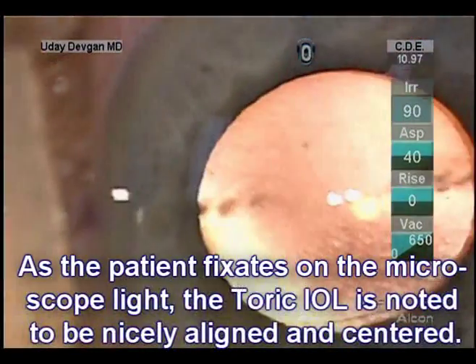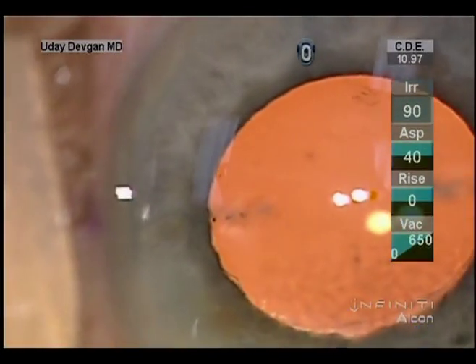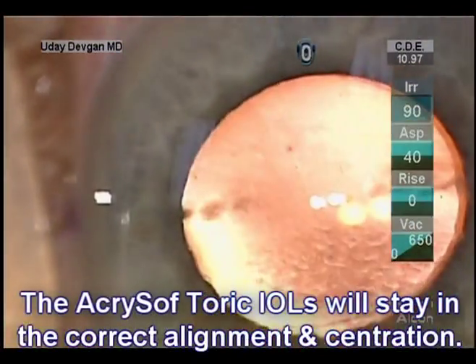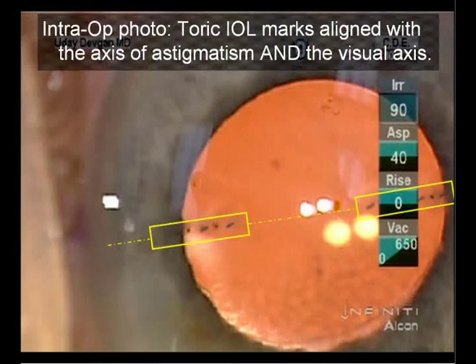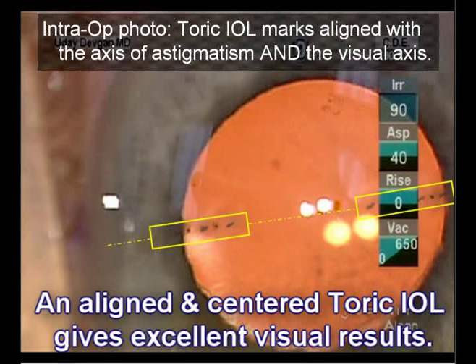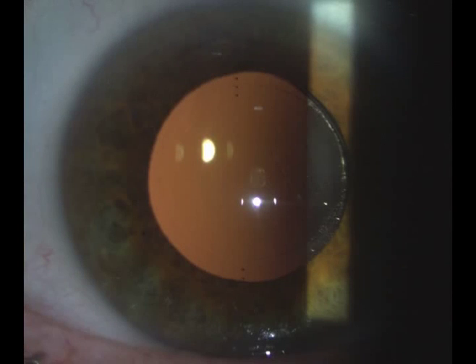Again, as the patient fixes on the microscope light, the toric IOL is noted to be aligned and centered. These AcrySof toric lenses will stay in this correct position. The intraoperative photo shows the toric IOL marks are aligned with the axis of astigmatism as well as the visual axis. This gives optimal visual results. Patients are happy, and so are the surgeons.